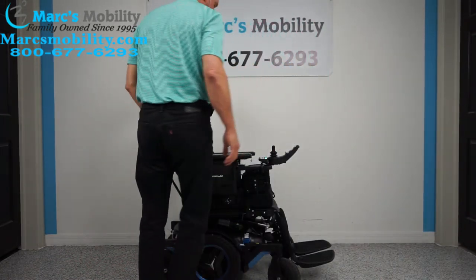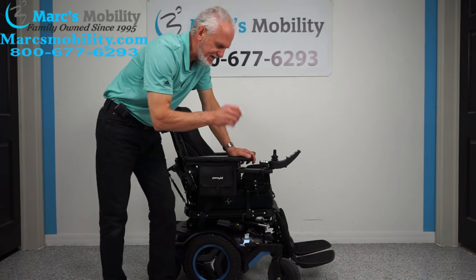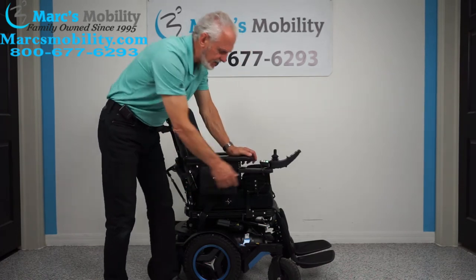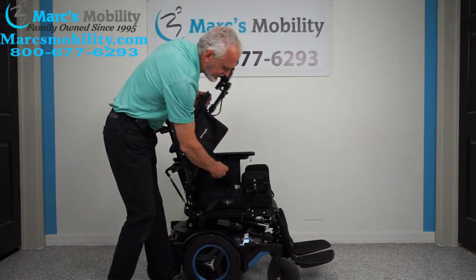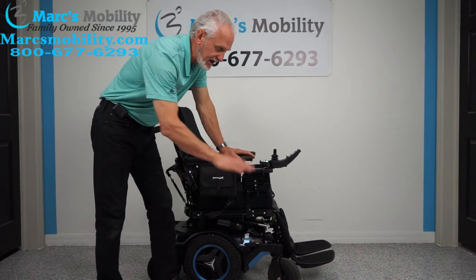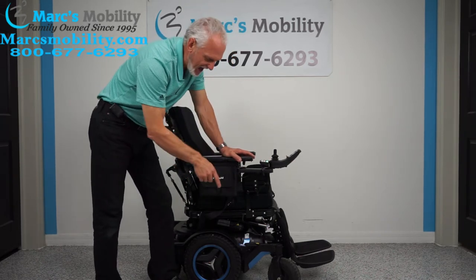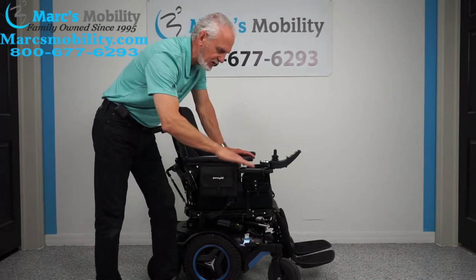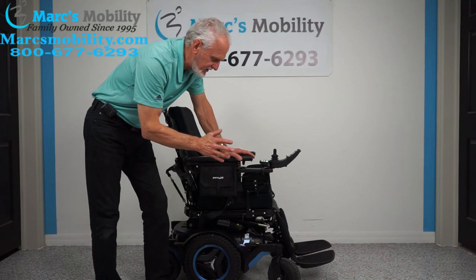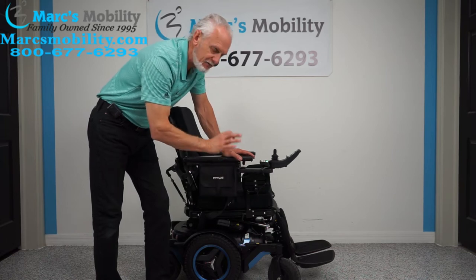Let's recap. We have a Permobil M5, dark blue color matching the frame and wheels. It has the aggressive tires, the full lighting package, arm bags, the swing-away joystick, the flip-up arm, the lateral pad, the air cushion, the safety belt, the USB port, the adjustable headrest, and the suspension. This chair is fully loaded: 14-inch seat lift, electric tilt, electric recline, electric feet, high-speed motors at 7.5 miles an hour. You can still drive at a decent speed with the seat elevated. This is a one-of-a-kind, expensive chair.